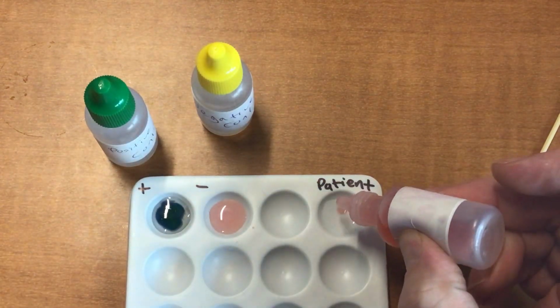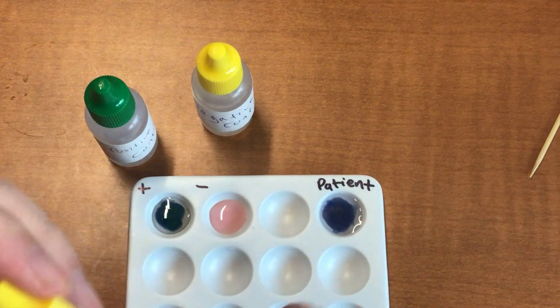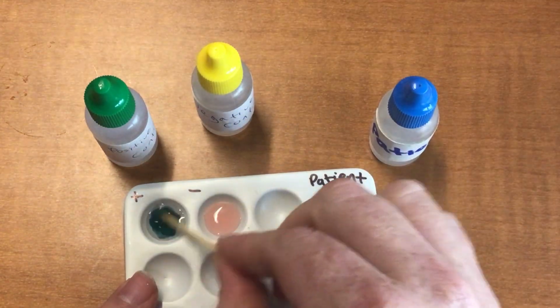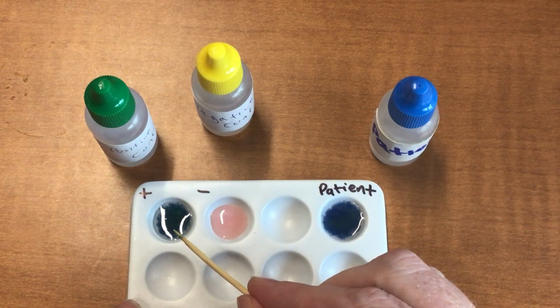So we pour that in there. And you can see that it in fact turned blue. So this is a simple case of our patient testing positive for salmonella, because we can compare. You can use your toothpick. You can mix it up a little bit. Compare them out. You can see that the patient here compares strongly to the one with salmonella.